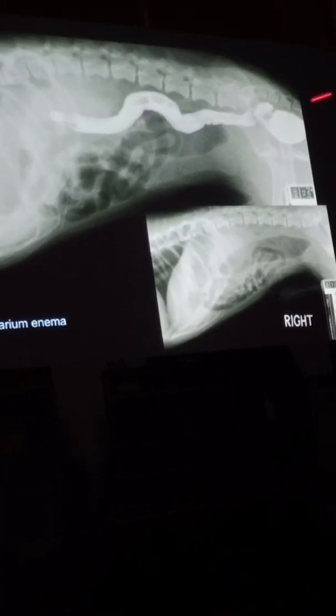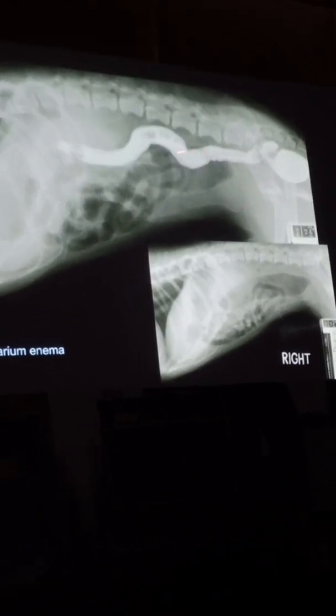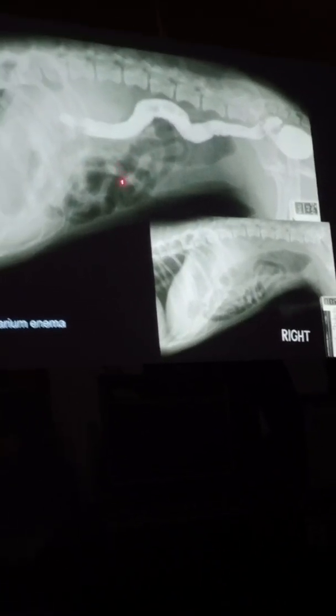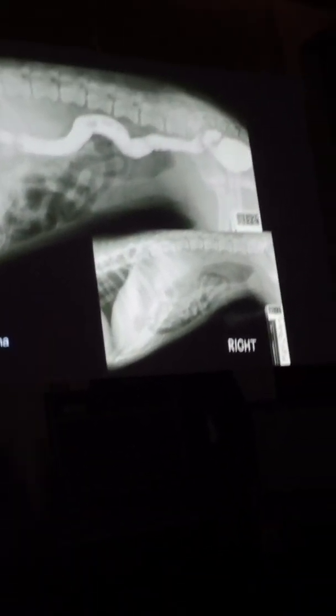So I put in a little barium, and in fact, there's the colon. That loop of bowel is still distended. And by the way, now there are some other loops of bowel that are abnormally distended. So we call this a partial barium enema.